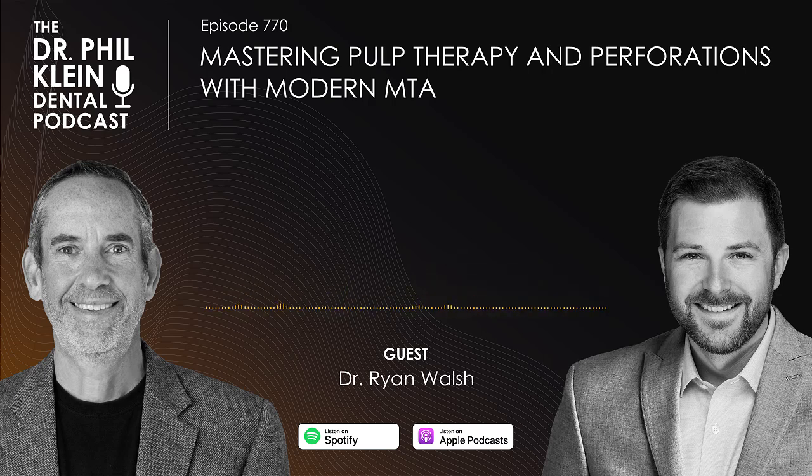We've seen cases back at 6 weeks, 2 months, and we started seeing some initial dentin bridging being laid down. And obviously, if you're getting out to 3 or 6 months, you can see some very definitive calcific tissue on the pulpal side of that MTA-like material.